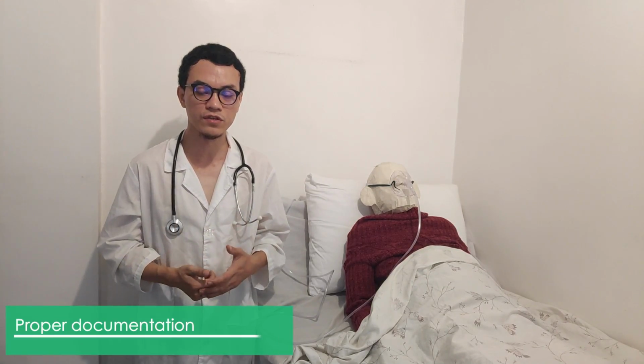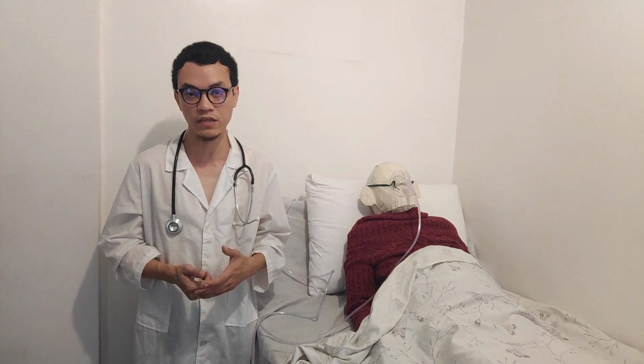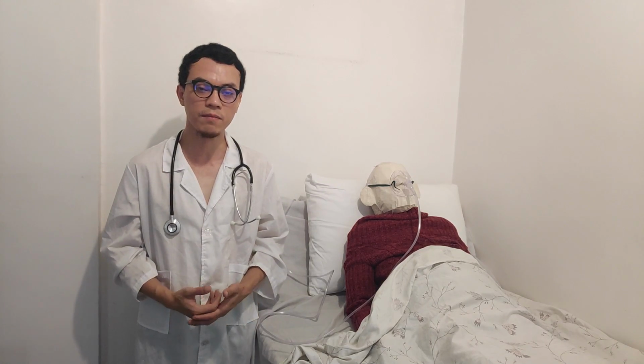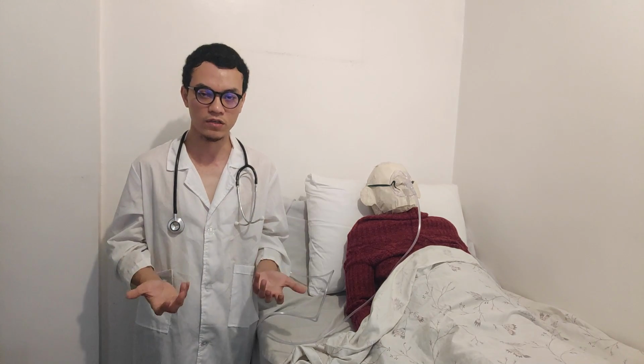And then lastly, document the procedure, findings, and results, and don't forget to sign the medication administration record properly. And that concludes my return demonstration on how to administer oxygen by oxygen mask.